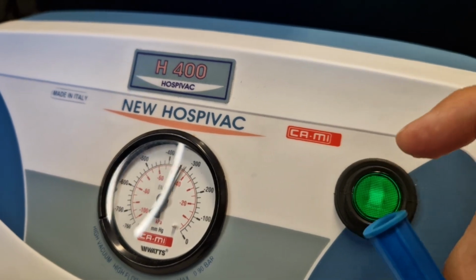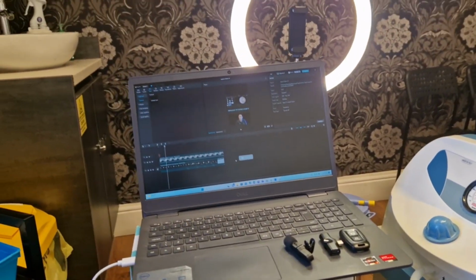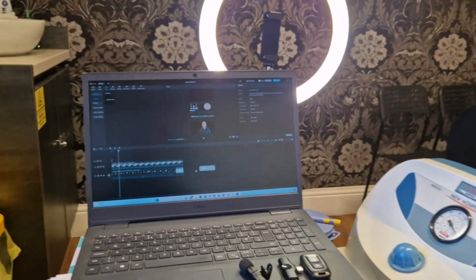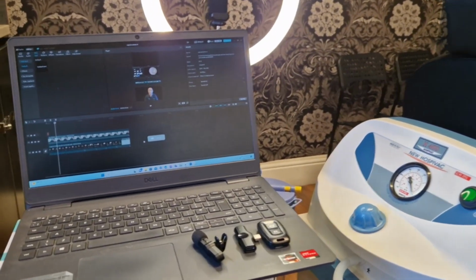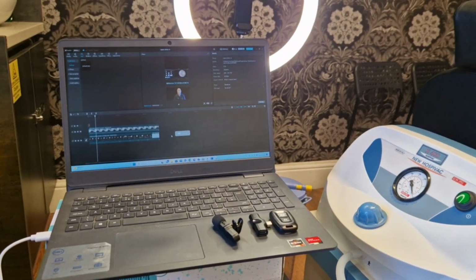Take it off, power comes back down. So that's why sometimes you see this procedure. Why is it not moving? It's not moving at all. That's because you're waiting. Let me turn that off. That's because you're waiting for that full seal, and then you can start to pull it out once you've got that full seal and the power has started to increase.